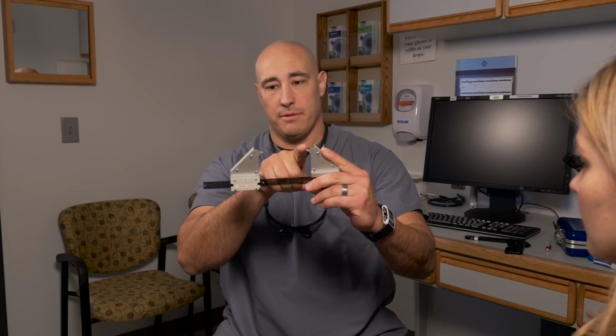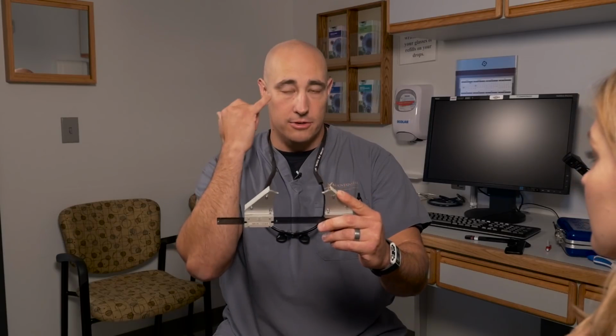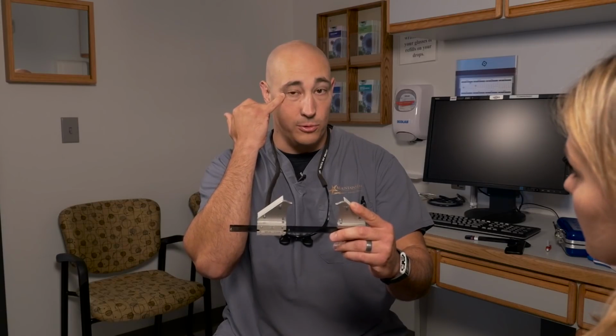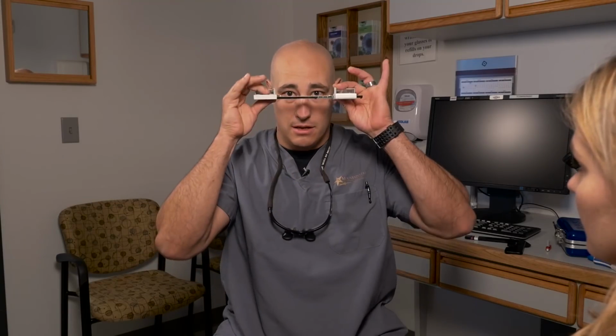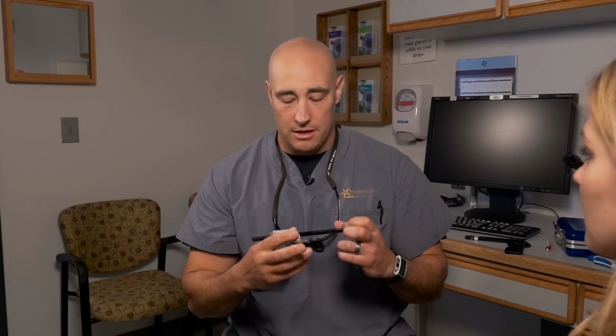This can be sort of a confusing test if they have fractures or facial deformities, but essentially what you're going to do is the curves of the exophthalmometer, I want these curves to rest right inside the lateral orbital rim. I try to use a target of the lateral canthal angle, where that hooks into the lateral orbital rim. Those are the points I'm shooting for. Okay, this can cause a little bit of a pressure sensation for a patient. It shouldn't be sharp, but especially if they have fractures or they're swollen, it can be a challenging exam. But do your best to get bony contact with the exophthalmometer so that you have accurate readings.